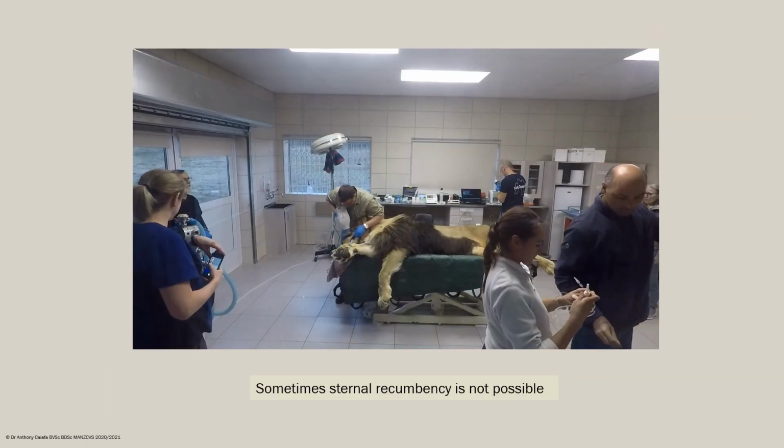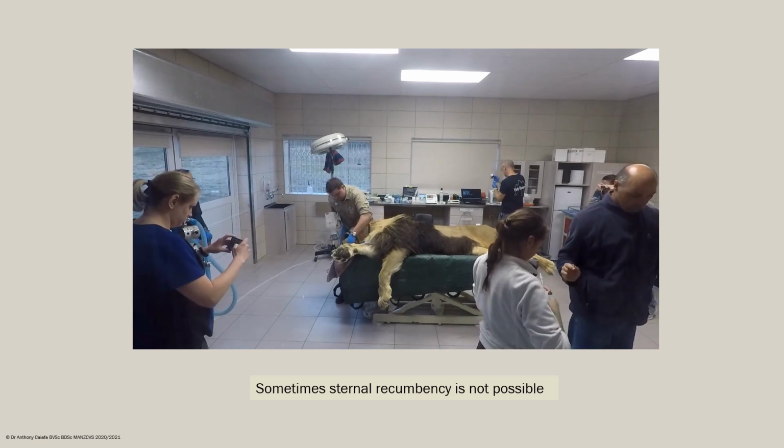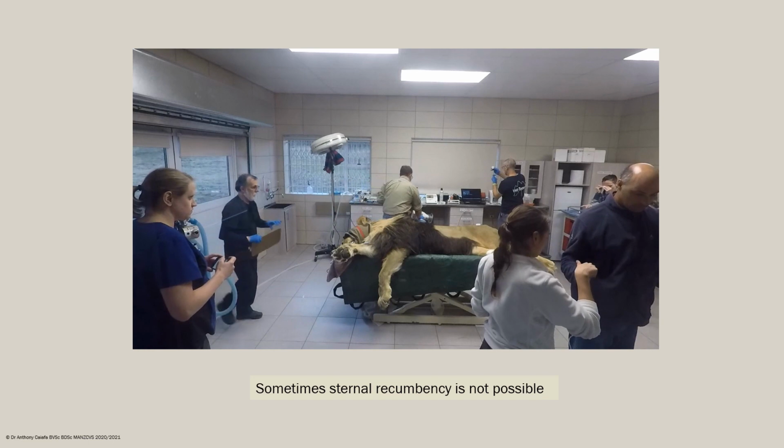Sometimes sternal recumbency is not possible, as you can see when taking a radiograph of this 180 kilogram lion.